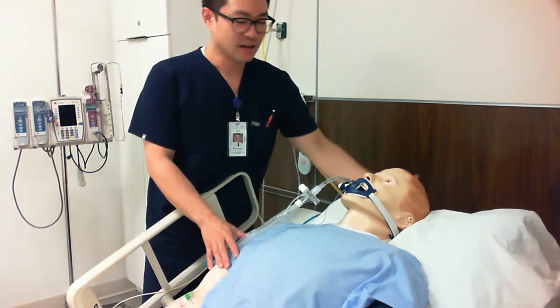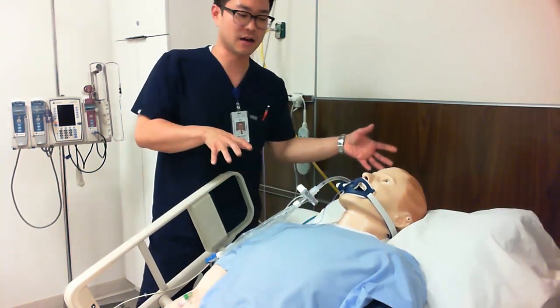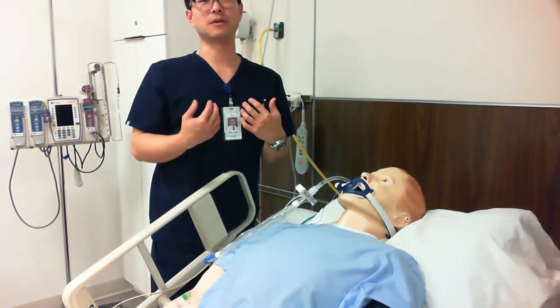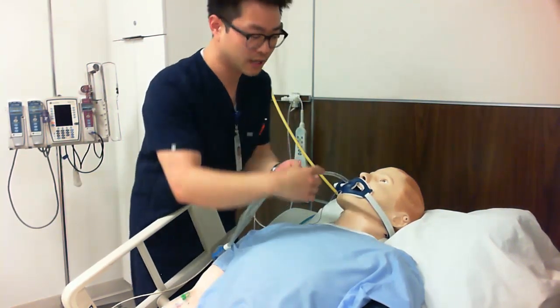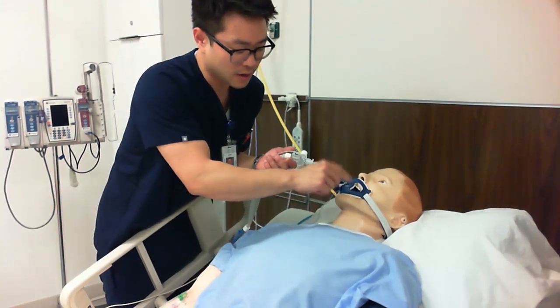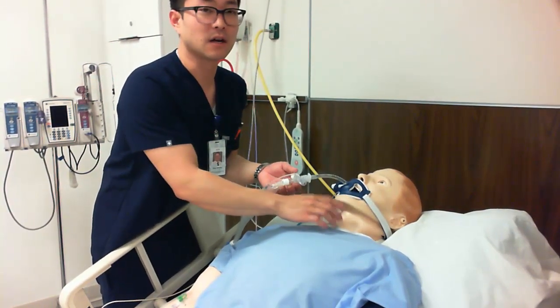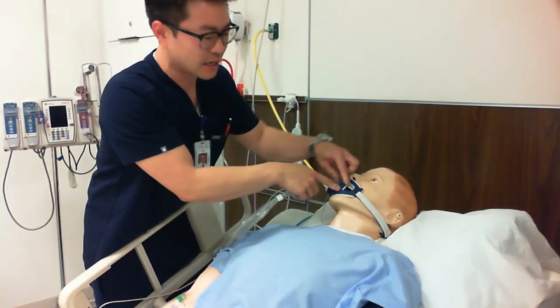Alright, so now that we're taking care of our patient who is intubated, we want to make sure that we understand different parts of an assessment for this type of patient. So when I come in and I have a patient that's intubated with an endotracheal tube, meaning one of these that goes through the mouth into the trachea, I want to make sure I know where that endotracheal tube is, and that means position. Landmarks are what I'm going to be using, and those are actual physical landmarks on my patient. So that does not mean that I'm going to use this anchoring device.